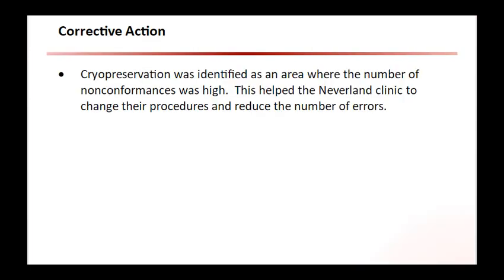Identifying areas that appear problematic can provide forewarning of where major errors may occur. As noted, the data indicated that cryopreservation was a key area to investigate. Adoption of more control in this area has been implemented in the Neverland clinic.